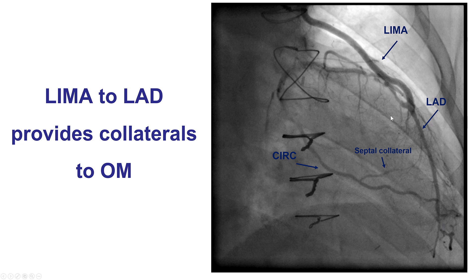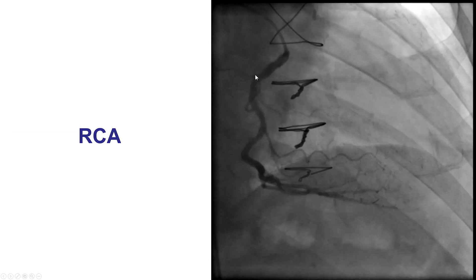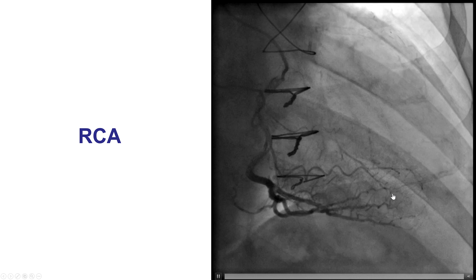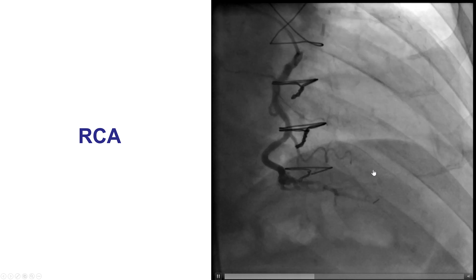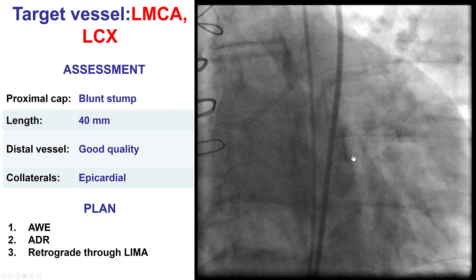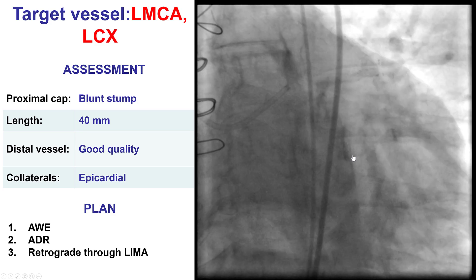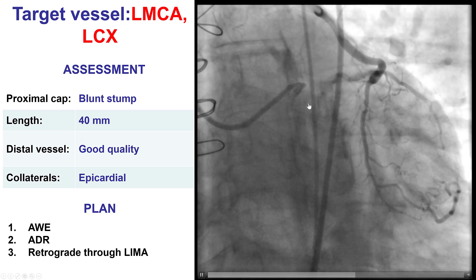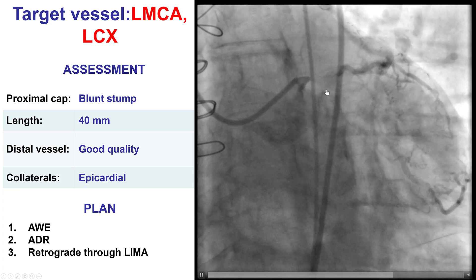So we have the LIMA-to-LAD, epicardial collaterals to the obtuse marginal branch, and CTO of the circumflex and the left main. The right coronary artery was patent and was also providing some epicardial collaterals to the distal circumflex. Therefore, the culprit lesion for the patient's angina was the CTO of the circumflex.